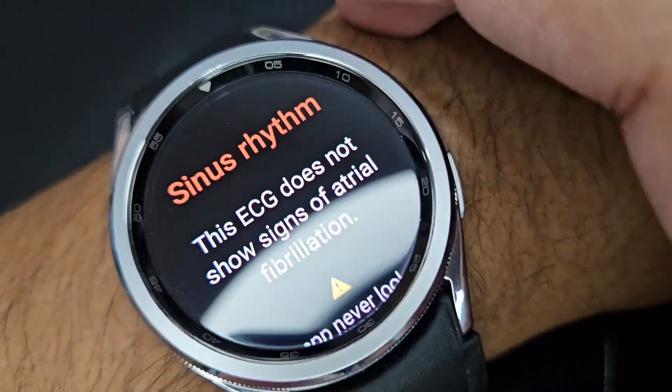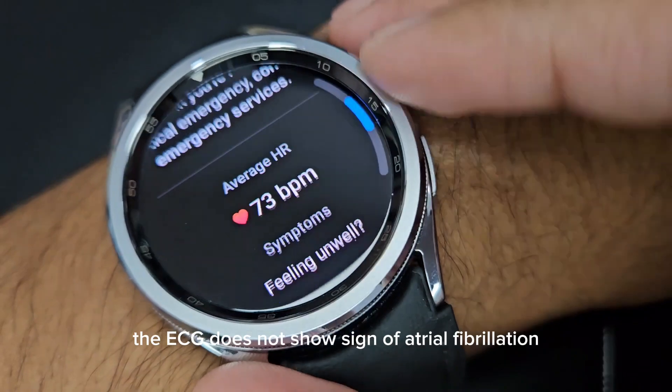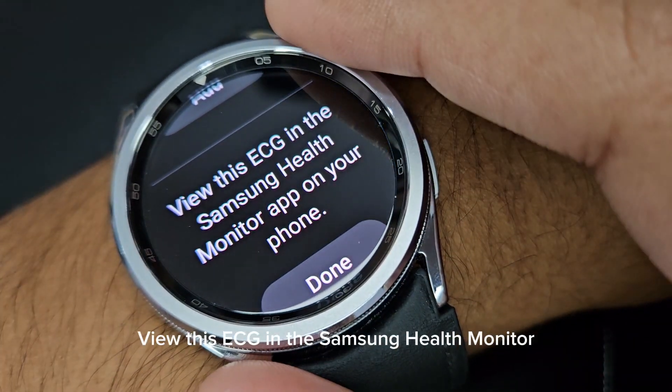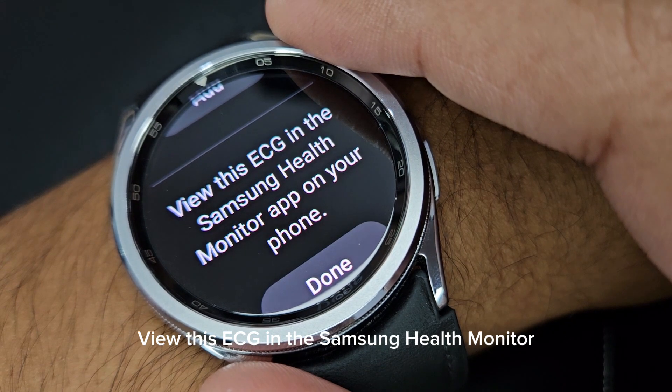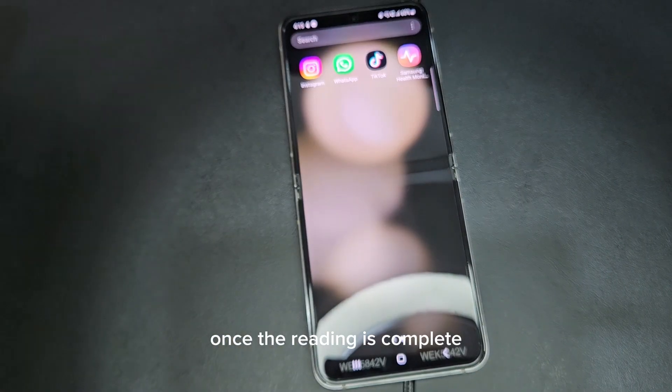There you go — the ECG does not show signs of atrial fibrillation, so that's my result. You can view this ECG in the Samsung Health Monitor app on the phone once the reading is complete.